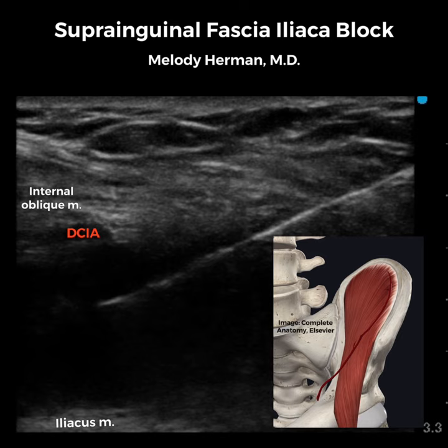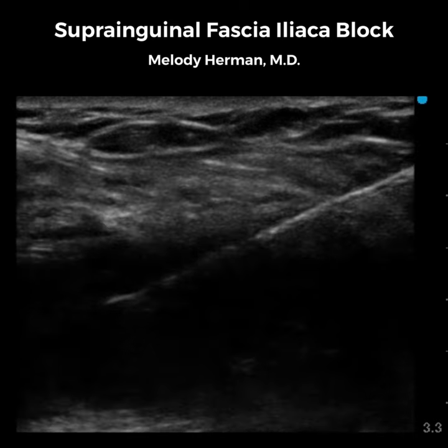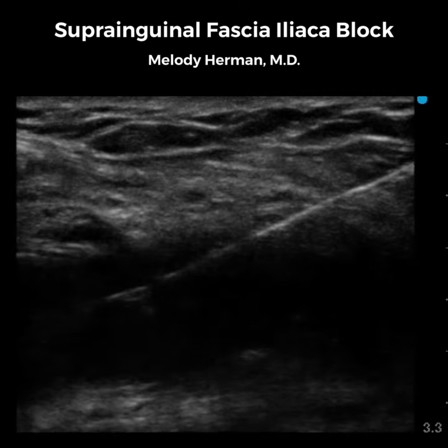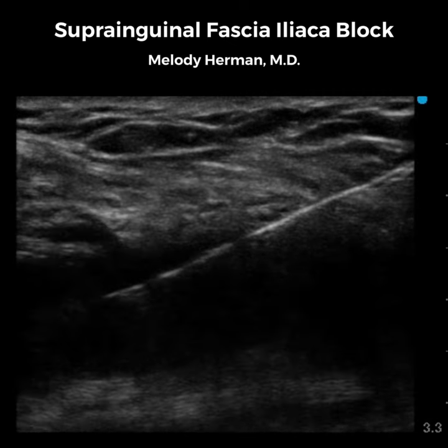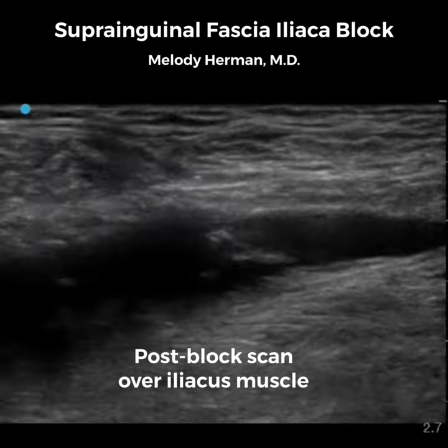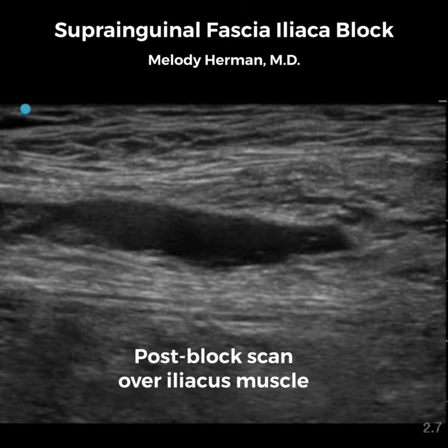Another indicator to confirm that you're in the correct fascial plane is to locate the deep circumflex iliac artery. The DCIA lies immediately above our fascial plane target and we'll see it lift as we inject between iliacus and internal oblique. In total, we'll inject about 40 mLs of dilute local anesthetic while being mindful of the maximum dose of local anesthetic your patient can safely receive.